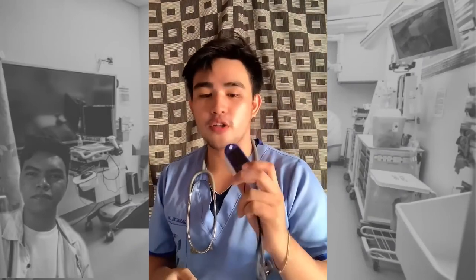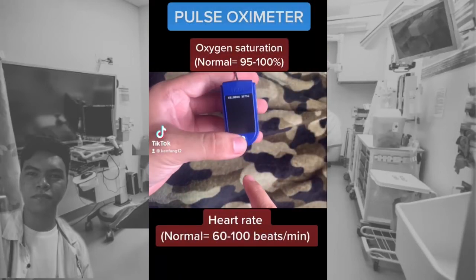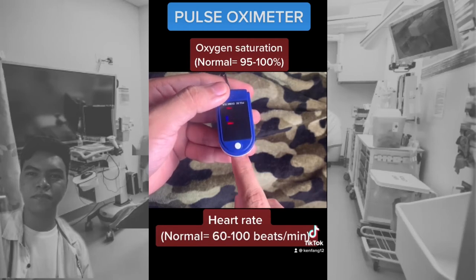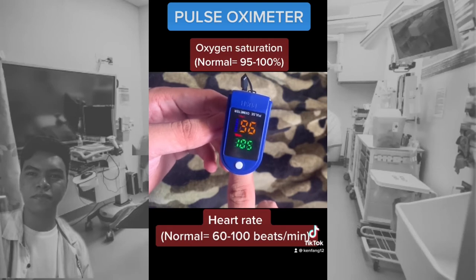Hello, today I will be demonstrating how to properly use the pulse oximeter. This is a pulse oximeter. It reads your oxygen level and your heart rate. Simply put it on your finger. SpO2 96, heart rate 104.